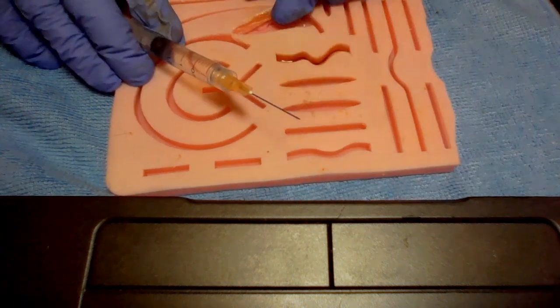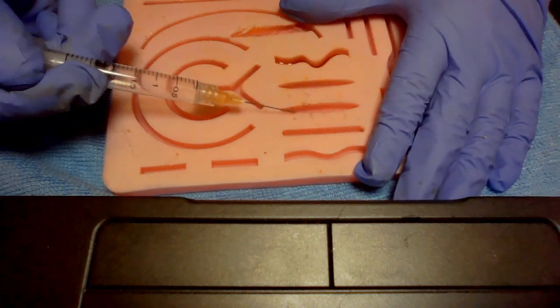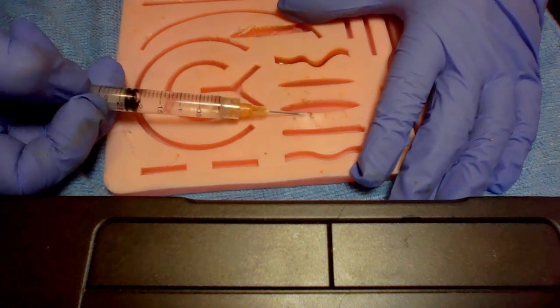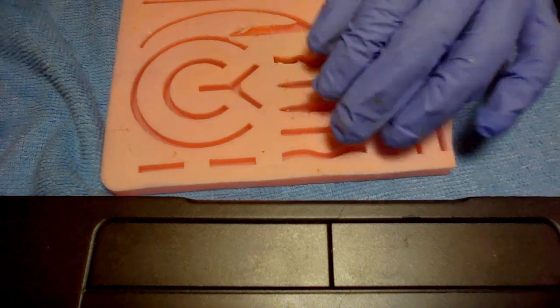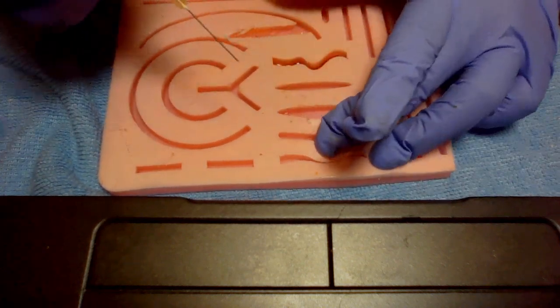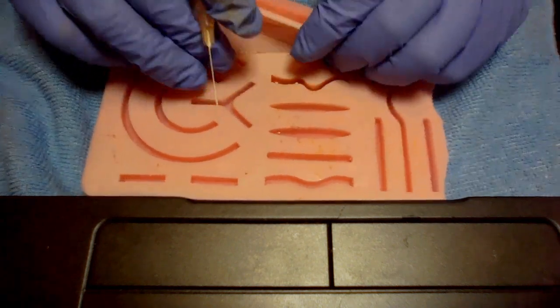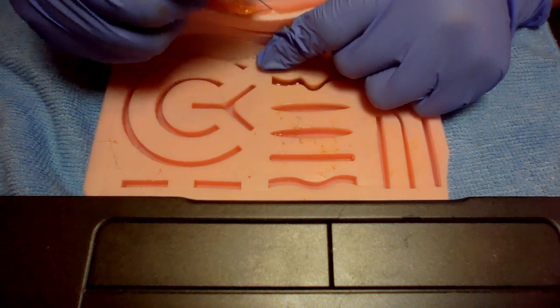In this particular model, it's not really made for anesthetizing, but that's what'll work. You see, I'm just going to go right in. Just like that. And that's how you do an epidermis injection. Next, I'm going to go in the dermis. As you can see, the dermis would be this middle part. That's the epidermis, and the dermis right there would be that middle part.